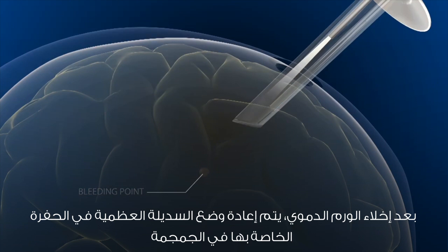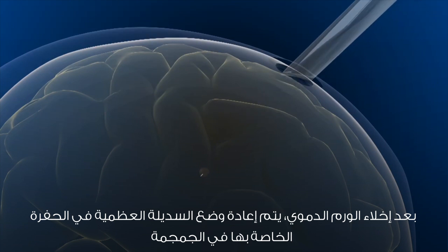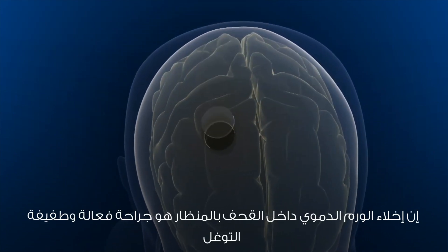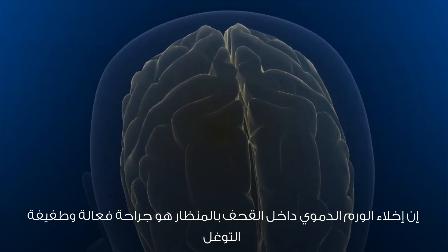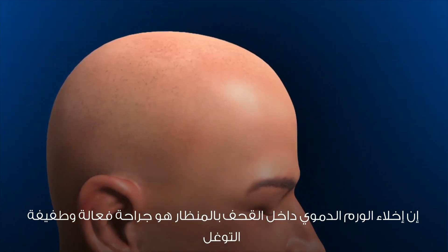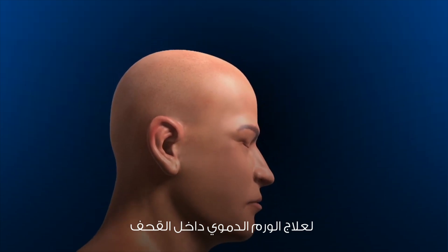The bone flap of the keyhole is repositioned and the skin incision is closed. Endoscopic evacuation of intracerebral hematoma provides effective and minimally invasive surgery for intracerebral hematomas.